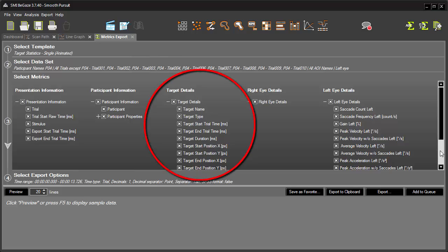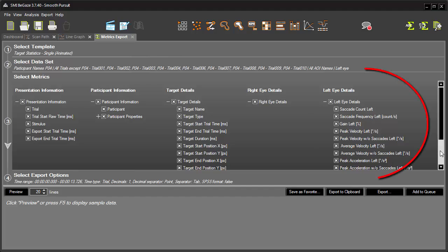Of particular note are all the target details, such as target type. In addition, numerous metrics for the left eye are available. For example, saccade count, saccade frequency, and gain.